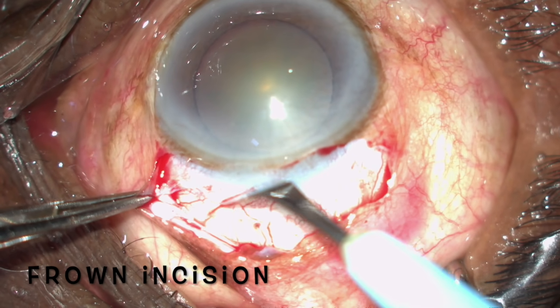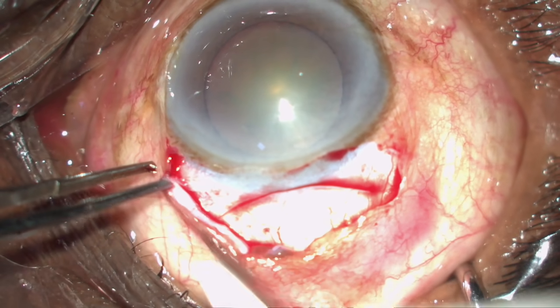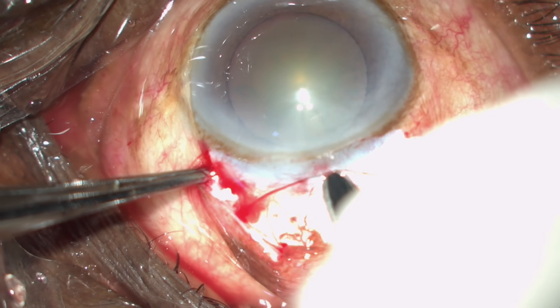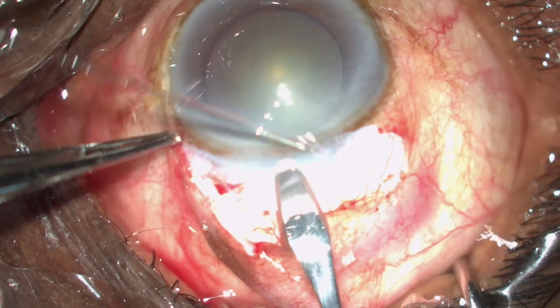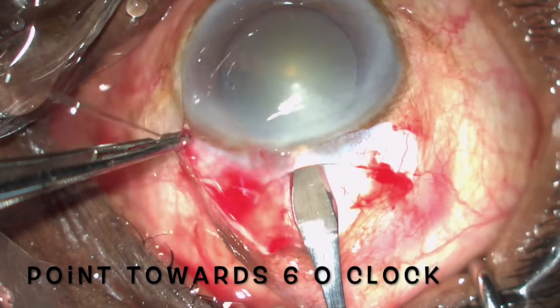The incision should be a frown incision, helping in astigmatism. After you make the incision, make sure that you deepen it before you start making the tunnel. Keep it a little vertical and deepen it two or three strokes. You will know the depth is sufficient when you keep it at the section and find the tip of the crescent engaging into the center. Then with a wriggling motion you can actually go inside.